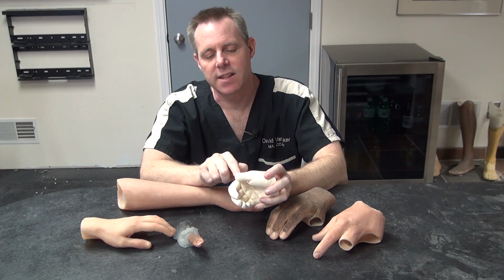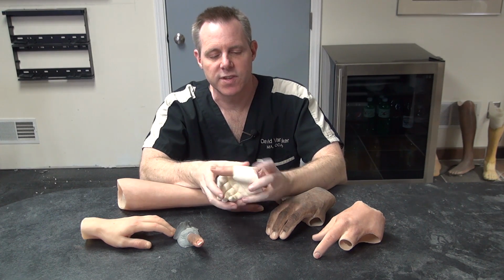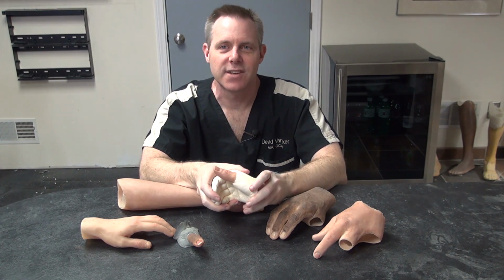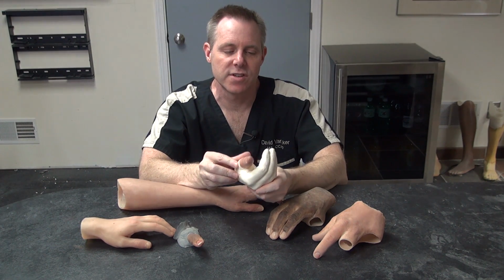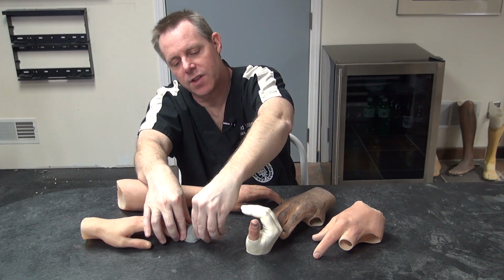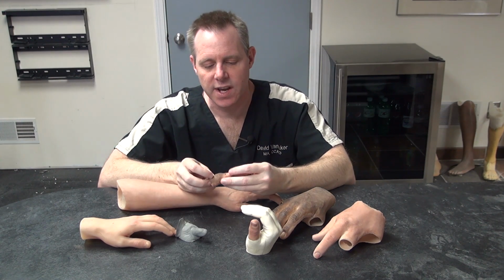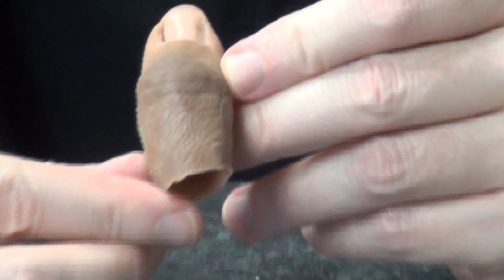When you've got length like this, you can usually create a reasonably functional prosthesis. When you've got no length, then that's just the opposite, and it's about as frustrating and dissatisfying of a restoration as we probably can create. I got this one here. I know it's another thumb, but again, this is internal coloration, so what it's to show you is that this is the color as it comes out of the mold, and then we just, hopefully with a little luck, we're just kind of blending a few imperfections and calling it done.